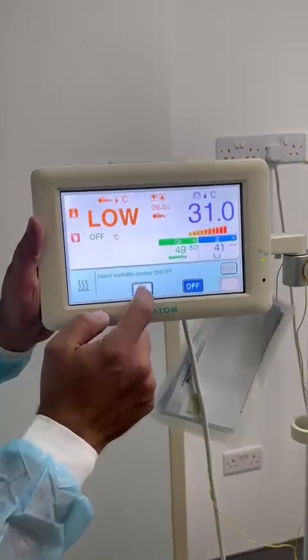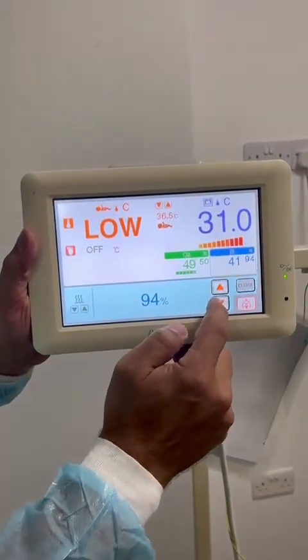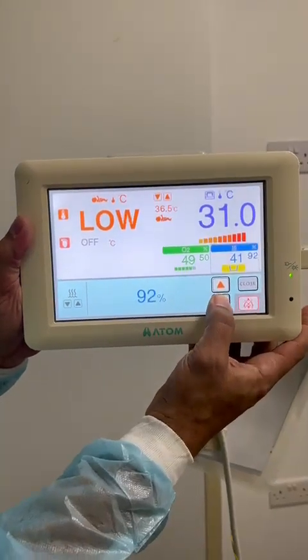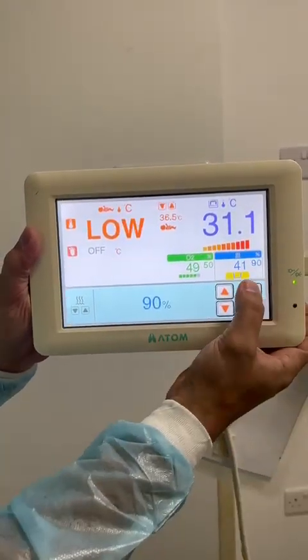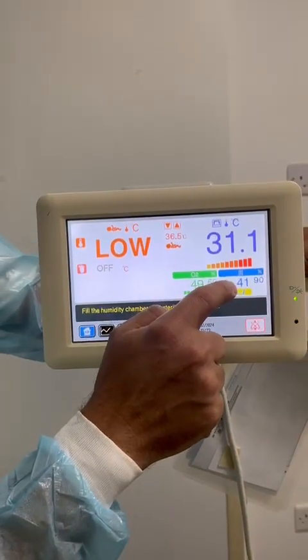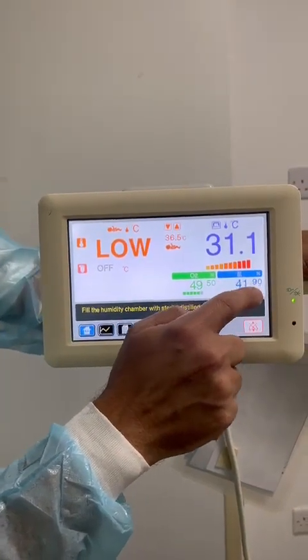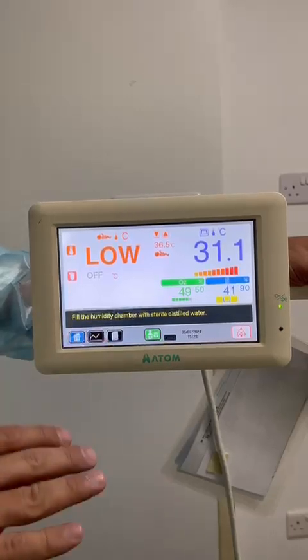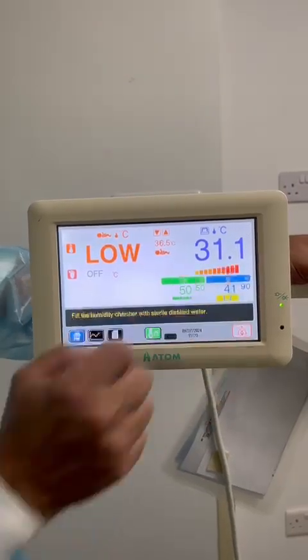Touch the display, select humidification on, and adjust the humidity level you are looking for — suppose 90 percent. As you can see, the actual humidity is 41 and the set humidity is 90 percent. Step by step it will start increasing until it reaches 90 percent.